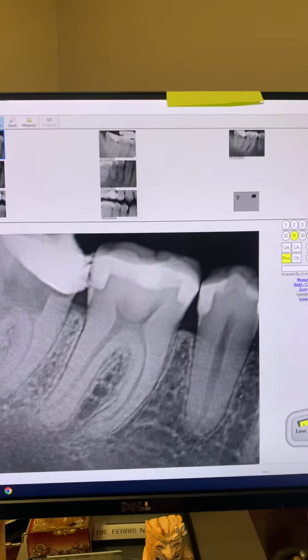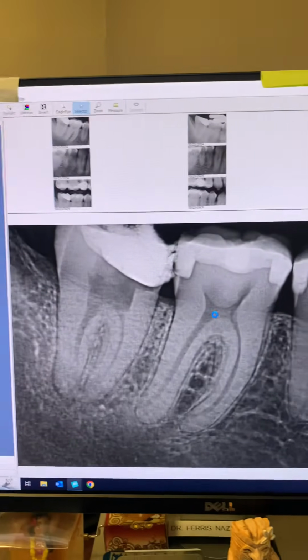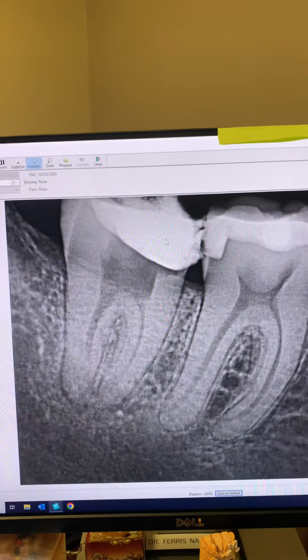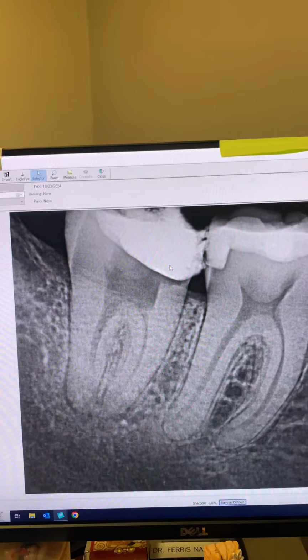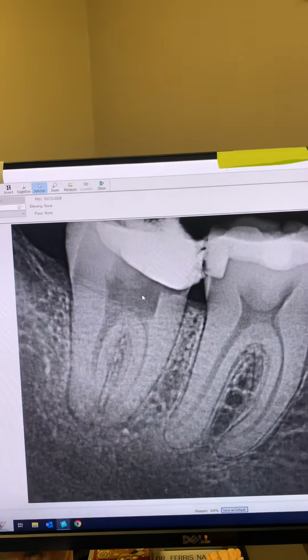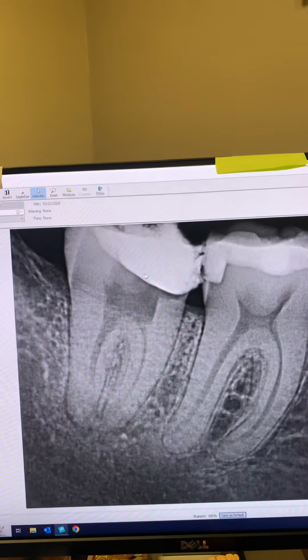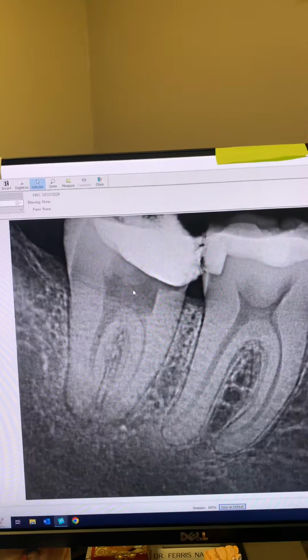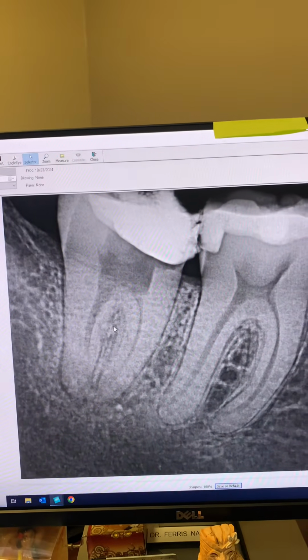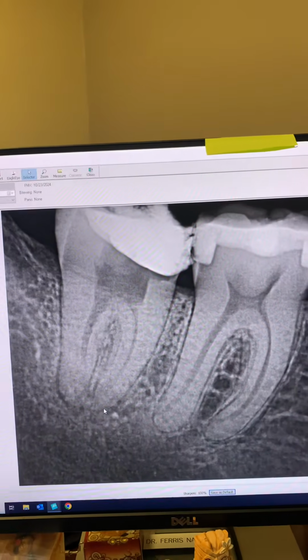So as I mentioned, the dentist tried to do the root canal on tooth number 31. So that's Cavit. The dentist removed the decay, did a pulpectomy for him, placed cotton pellets in here and more Cavit, and referred the patient to us for IV sedation. And that's what we did today. So we did tooth number 31, as you can see, periapical radiolucency as well.